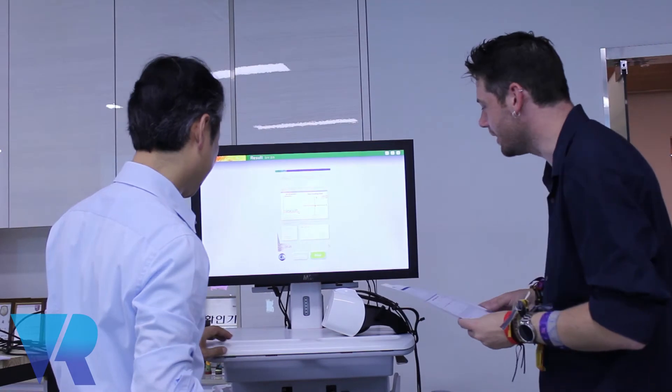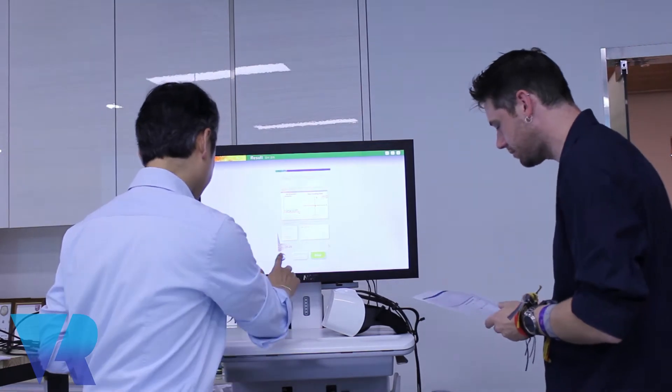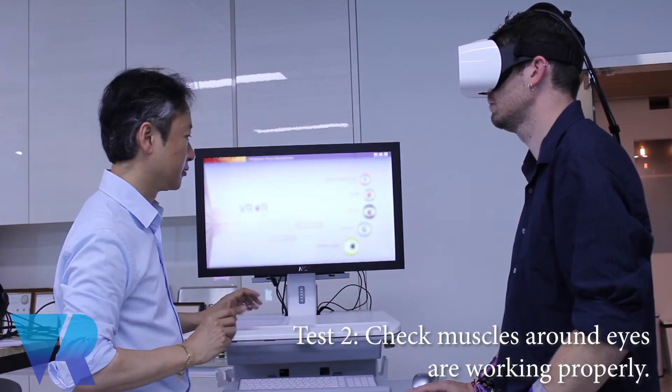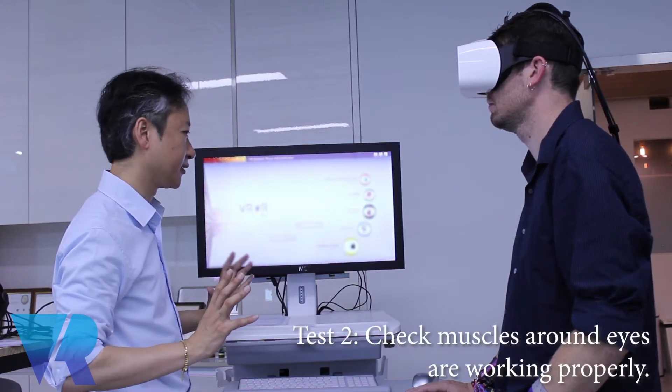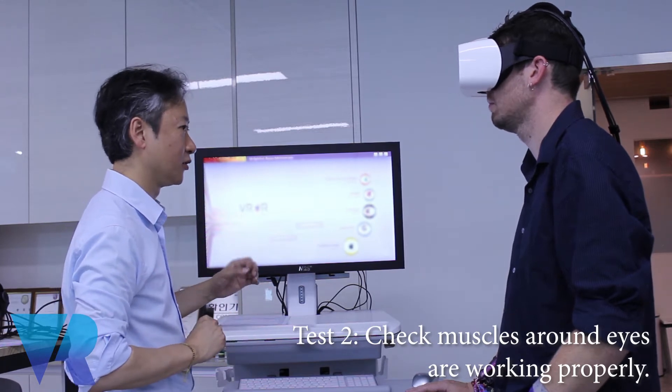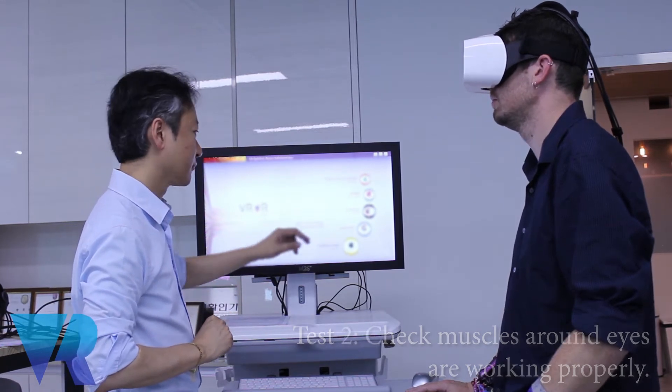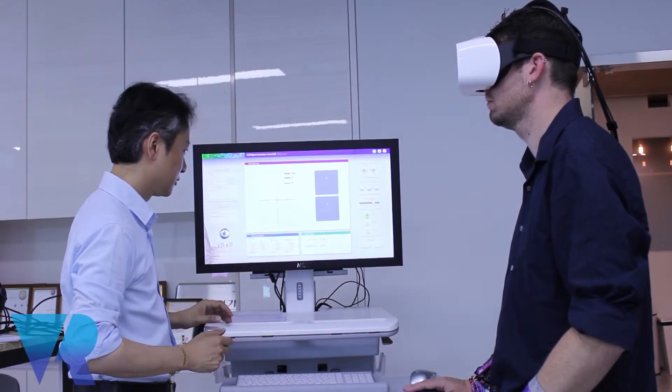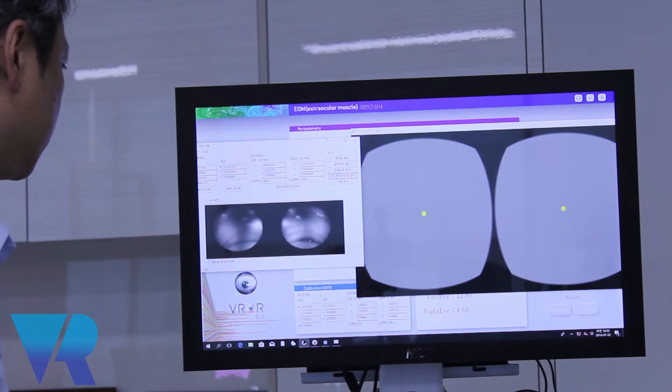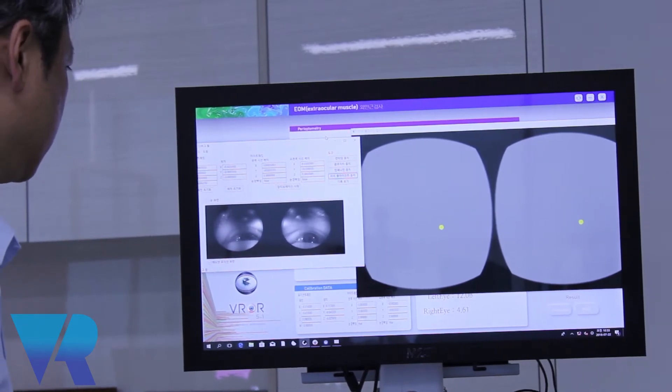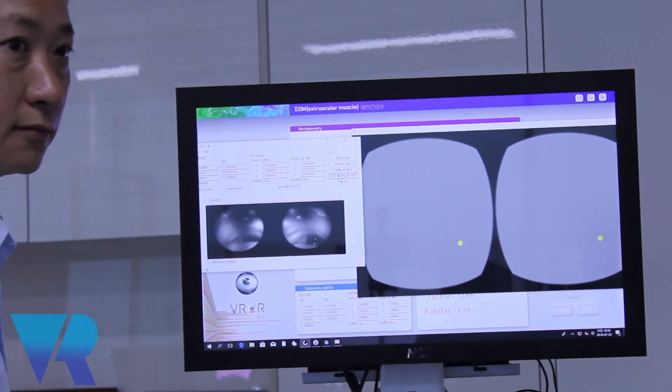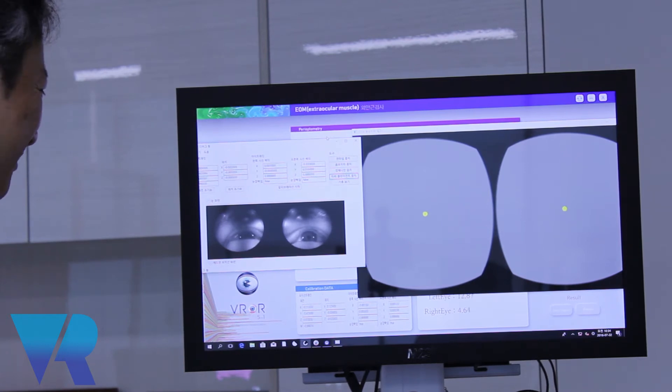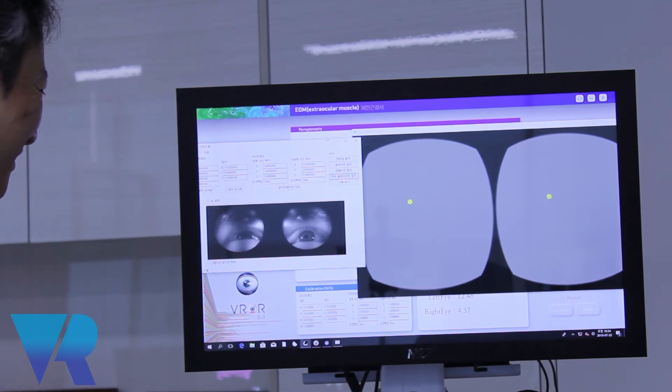What's next? Process-wise, pretty much the same. You're just staring at the yellow dots. Running. Are those his eyes? Yes. Are they pretty? Yes, they are.